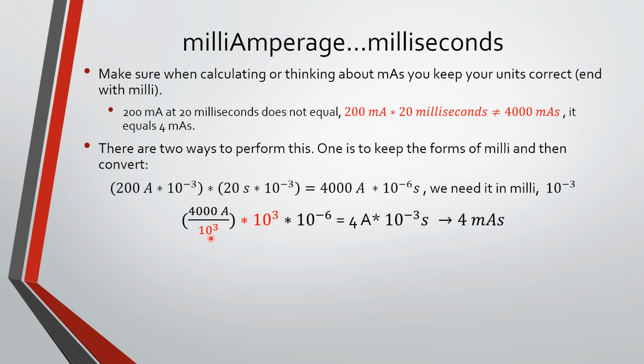We're just converting the units is what we're doing. So we're converting from micro to milli here, okay? So this 10 to the 3 times 10 to the negative 6, if we remember from the math lesson early on in this series, it will go to 10 to the negative 3. These two just add together, essentially, when the base is the same, okay? And this is the same as moving the decimal point over 3, okay? Or dividing by 1,000 is what this represents right here.